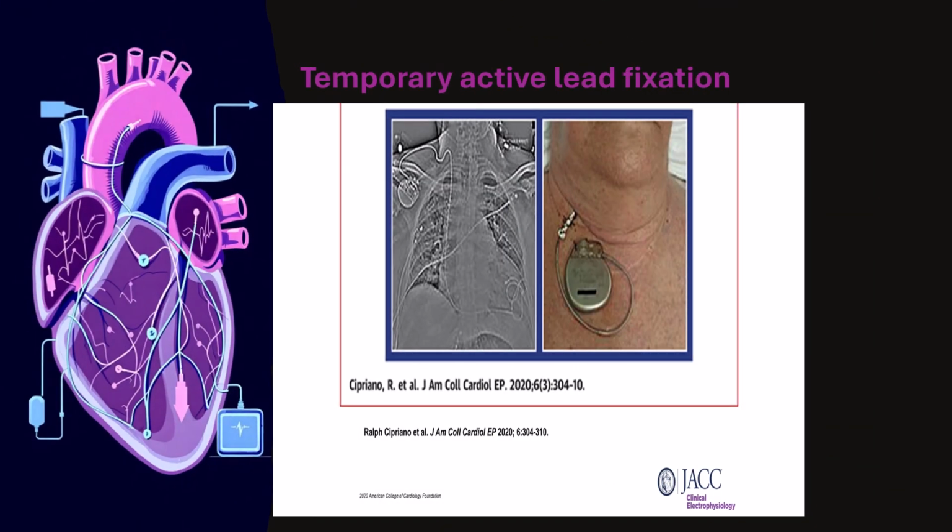Active lead fixation. This is used in patients with infective endocarditis or device-related infection, especially patients who are dependent on the pacemaker. It will be difficult to use the femoral site for 2 weeks or more until the antibiotics are finished, as the patient will suffer from DVT and there will be limitation in the mobility of the patient.